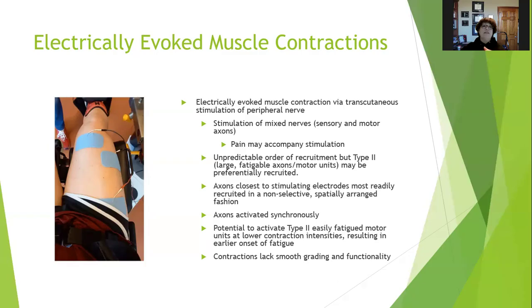If you're doing functional electrical stim with a patient, you should let them know that it can be kind of painful. And it has to go with their tolerance and how much muscle contraction you're getting. So there's a lot of individuality to the treatment.